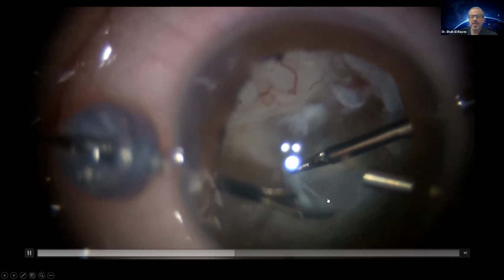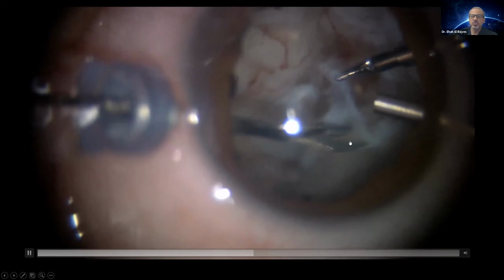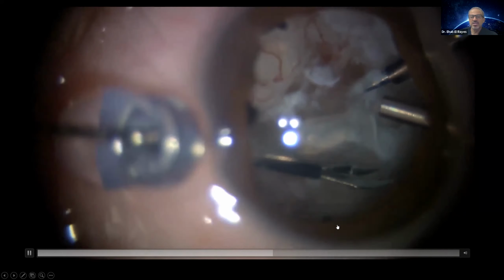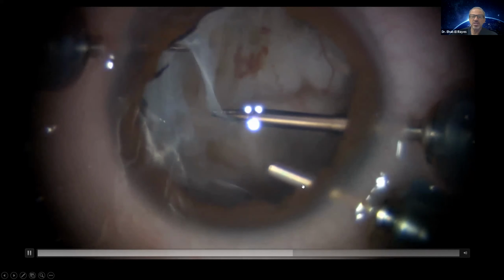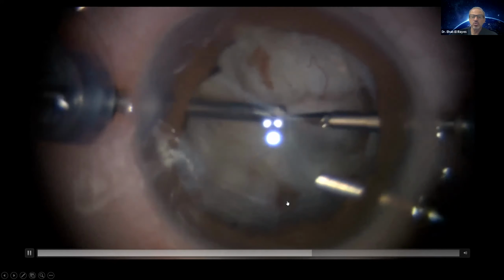It's very important, and you can see why this retina looks like exudative retinopathy, not just traction, because there is a lot of subretinal blood. So once you start removing as much as possible from the retinal surface all these sheets and identify the retina, then you will deal with the subretinal blood later on. It takes quite some time to clean the retinal surface. Bimanually, you have to understand the anatomy and why the retina is twisted like this. So bit by bit, you remove the correct planes and the correct vectors. Once you do this, the retina will start to open.